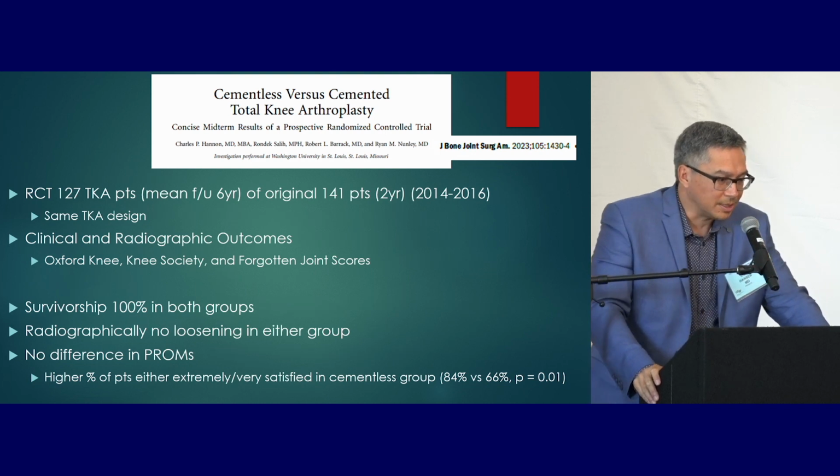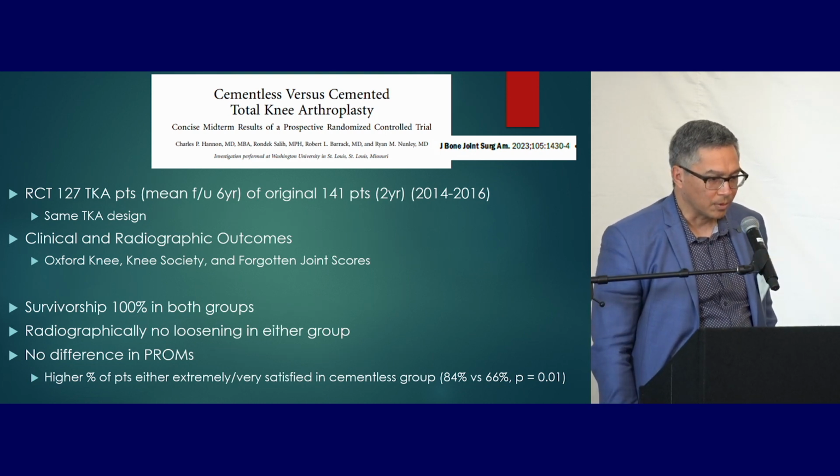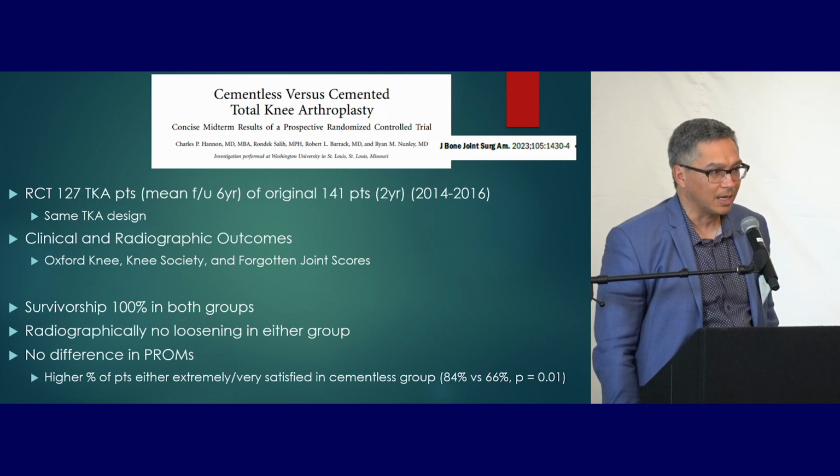So my question to the panel is, does it make sense that we're following these to 6 years? If we were talking about failure of fixation of a primary femoral stem, it would happen relatively early. So what is the value in following cementless fixation for 6 years?